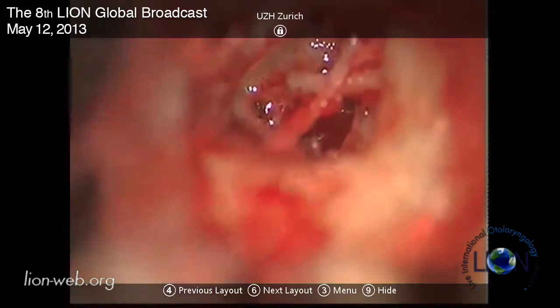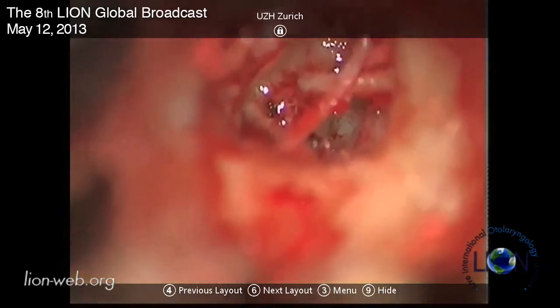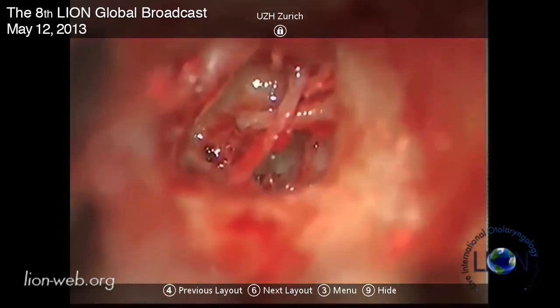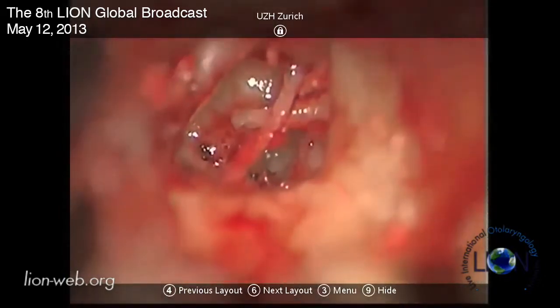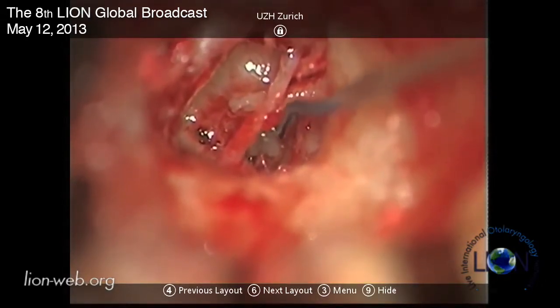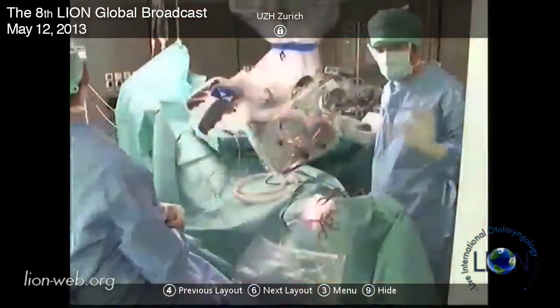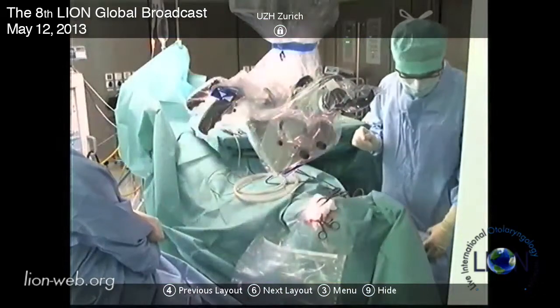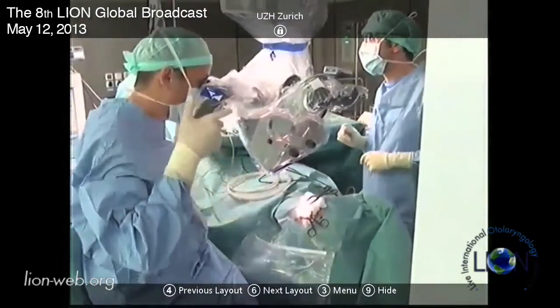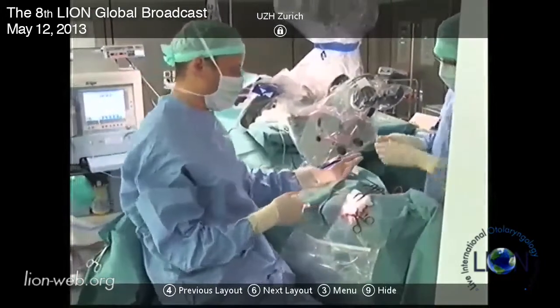Good, and now I always measure - I think it's important to measure the length. There's just a little bit of blood. The patient is under general anesthetic - what's the systolic blood pressure? Blood pressure is 82 on 50. That's really interesting because all four patients we've asked about blood pressure today have been very close to that - top marks to the anesthetist all round.